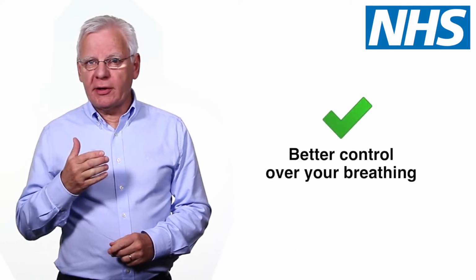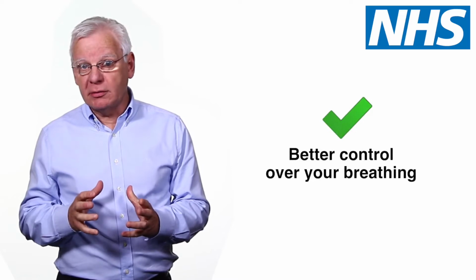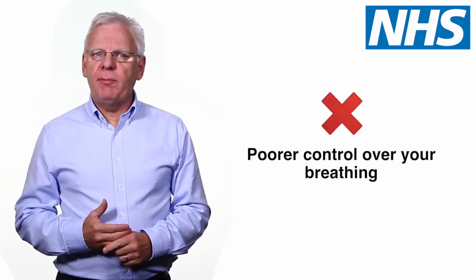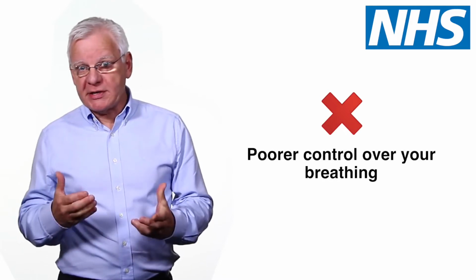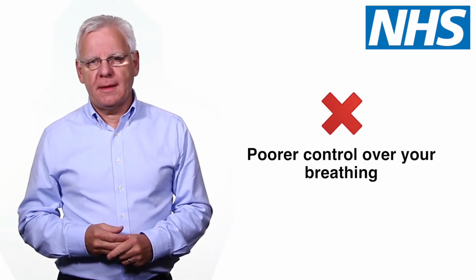If you use your inhaler correctly, you'll get more of the medication into your lungs, giving you better control of your breathing problem. But if used incorrectly, you'll have poor control of your condition, with the risk of side effects, such as a sore throat or mouth infection.